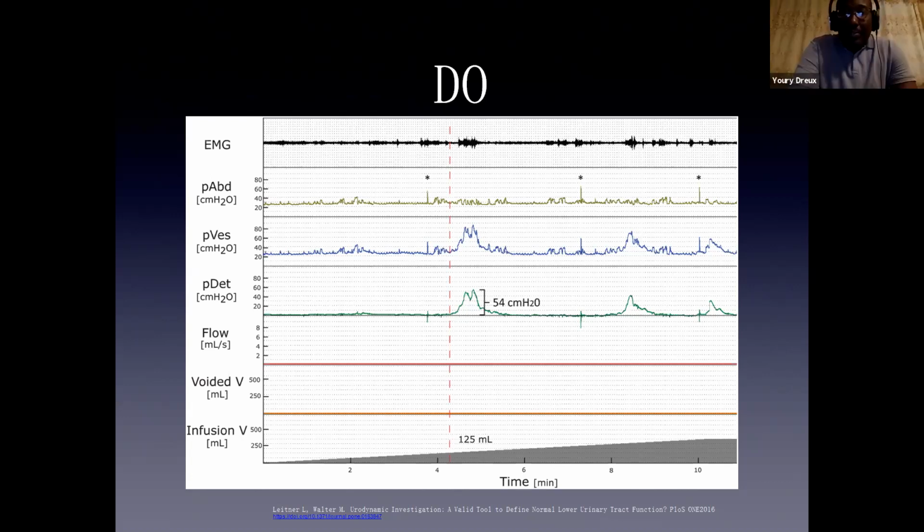It's not prostate cancer, in terms of new data and new treatments. It pretty much has been the same for many years. We're still using Dr. McGuire's storage pressure of 40 centimeters of water as the risk to the upper tract. So with the information and resources that you already have, when you are able to start doing it, you'll have things to look back on, and you don't have to have the newest and greatest up-to-date study, because it hasn't really changed all that much.